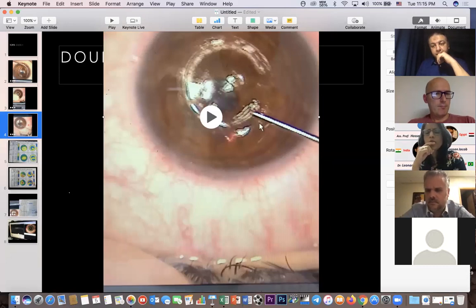I like to do double segments. I would say I've done double segments more frequently. I have done 360, 330 also. But somehow I do much more double segments, as I guess any ICRS segment surgeon would be doing. Yeah, okay. Thank you. Dr. Leonardo?